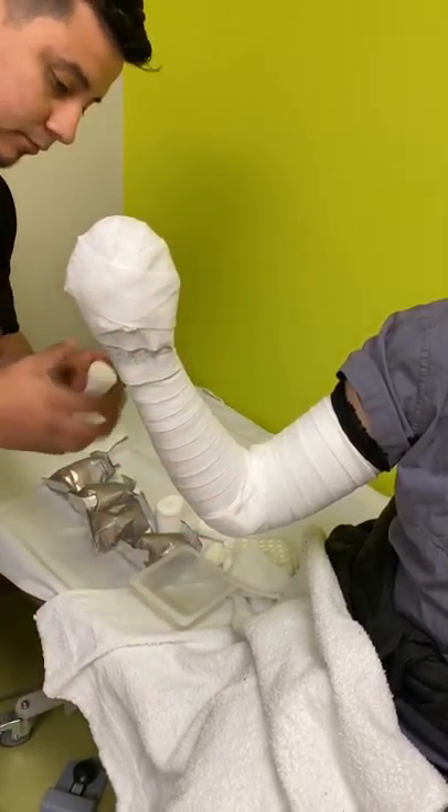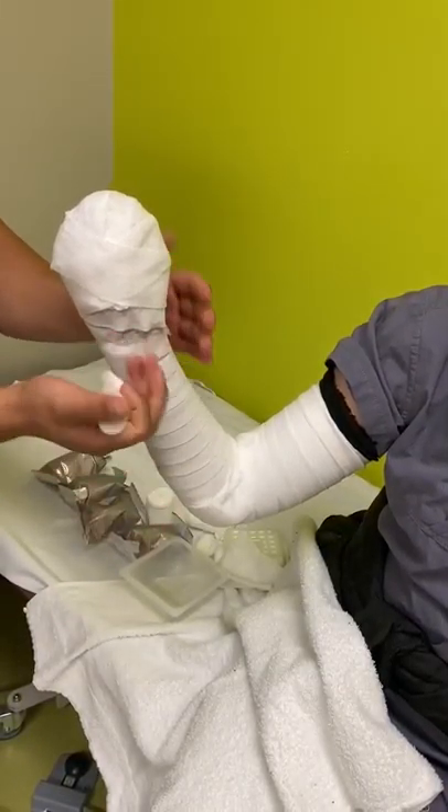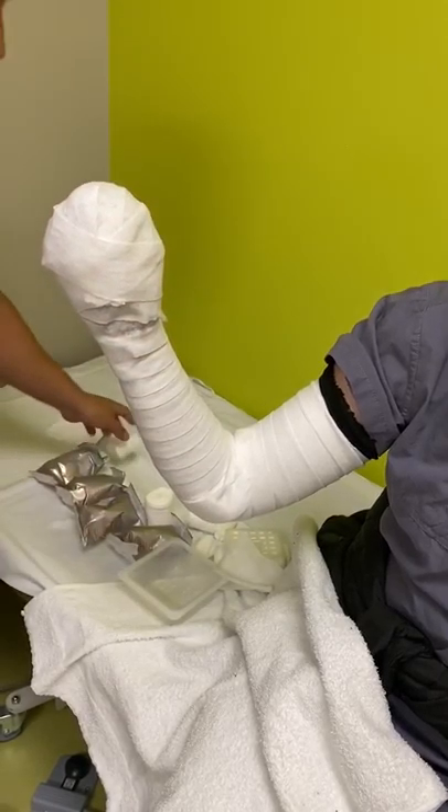This part can get a little bulky. This is an adult patient, so it's a much bigger arm than what you're looking at on a four-, three-, or two-year-old patient.